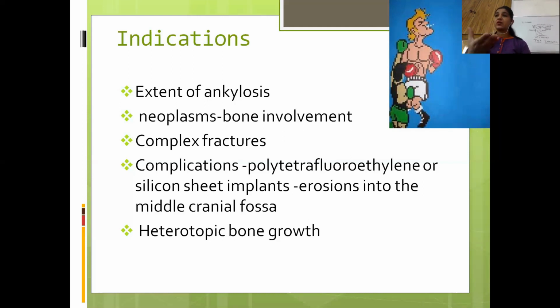So they are also visualized in CT to see the extent, exactly the depth of the implant where it is kept. Then heterotopic bone growth.